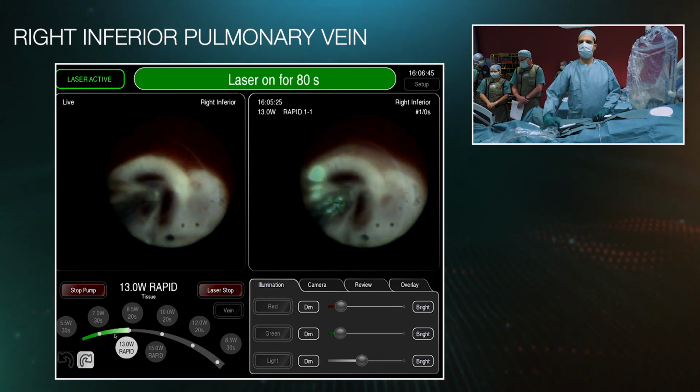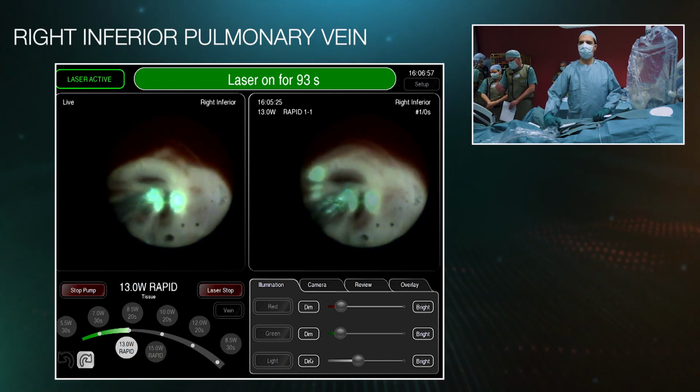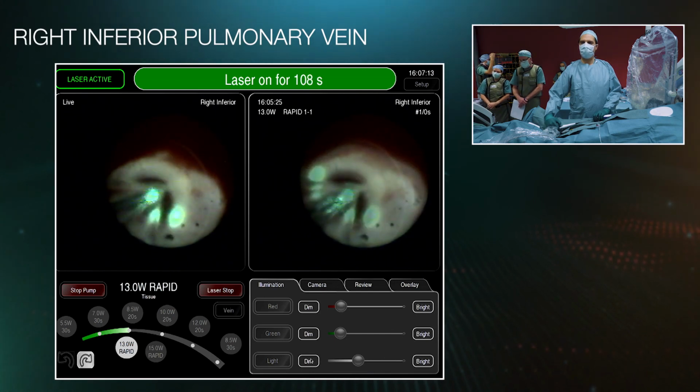Again, you can see a nice lesion formation, nice edema formation. The top half, let's say, of this vein clearly looks different than the bottom half. Clearly has undergone some edema-related changes. It's one of the very nice things about laser ablation, of course, is if you have a view like this, your energy delivery is not dependent on contact. There's literally nothing that can go wrong in the ablation in this position. In terms of lesion efficacy, if you can see the tissue and shine a laser on it, you will always make the same lesion. You will always deliver the same amount of energy to the tissue.